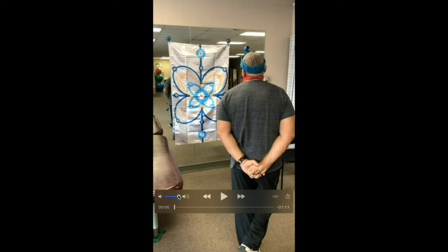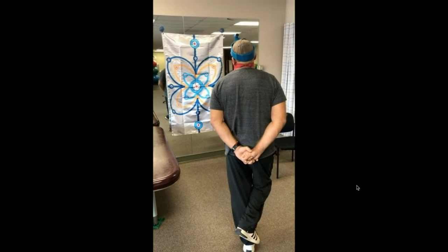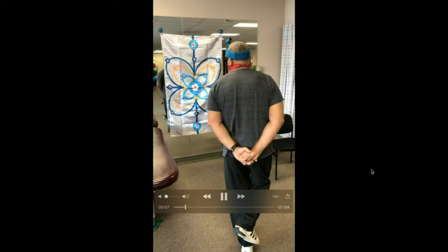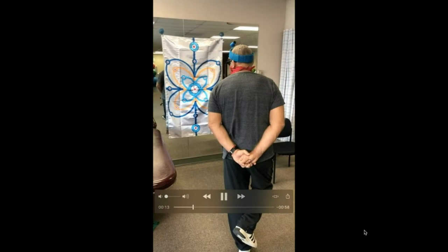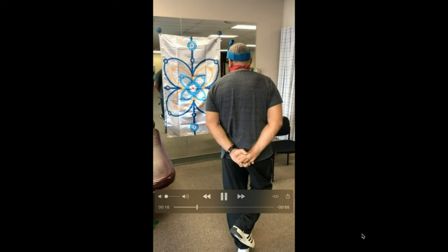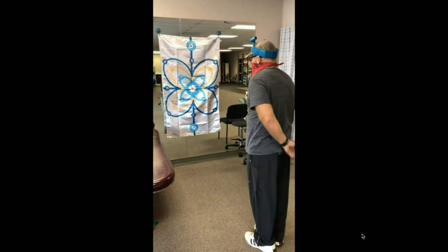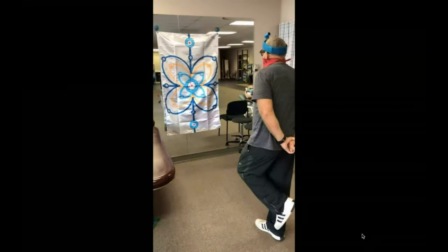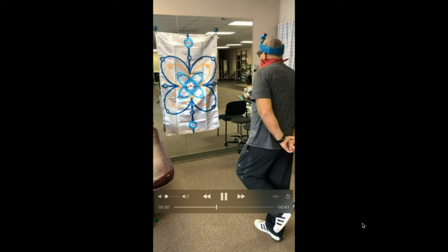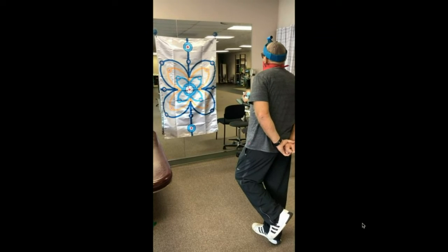So in this application, we have this person in single leg stance, and he's going to go through the combination of times zero viewing, so motor control tracing in single leg stance, and he's doing an infinity pattern here. So why would I want him to do this? As I challenge the system more and I narrow his base of support, we might see more decompensated activities there. And it's giving me a below and above axis representation here. So as he goes to the other side with 45 degrees, so he's pointed off axis, off the target with his torso, he can either do the small motions or he can do the large motions, which I think he's going to go through here.